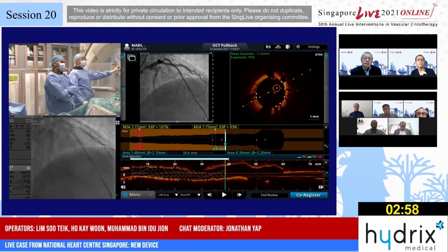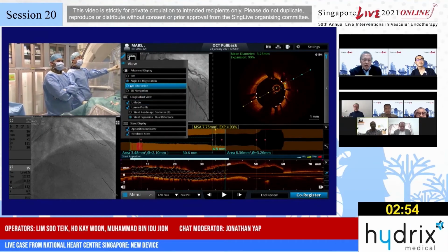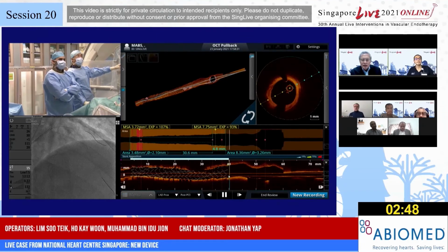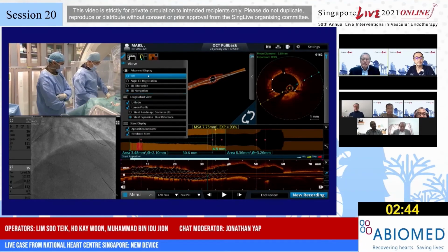Going to do the fly through? Yeah. So you've got about 3 minutes or less. Okay. Before we conclude, maybe one last final shot without the wires. Yeah.